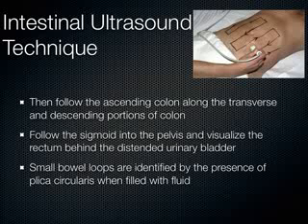When I'm doing a focused appendicitis exam, which I do quite often in the ER, I keep this mowing the lawn technique just around the right lower quadrant where the appendix is located, what we call McBurney's point. Or sometimes I just hand the transducer to the patient and say, put this where the pain is. Then they push it on their abdominal wall and help localize where I should start my search for the etiology of their pain.